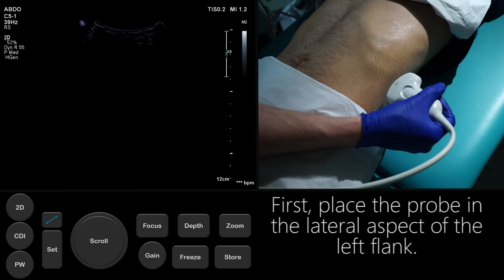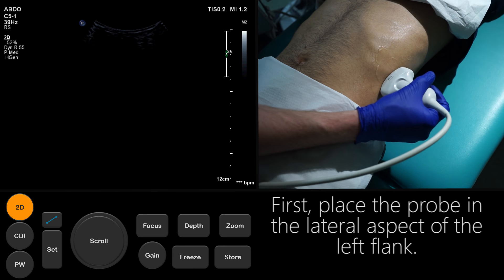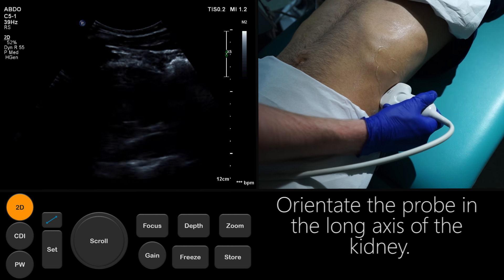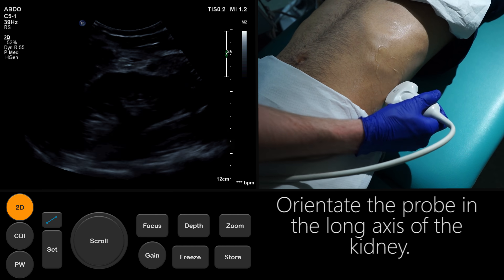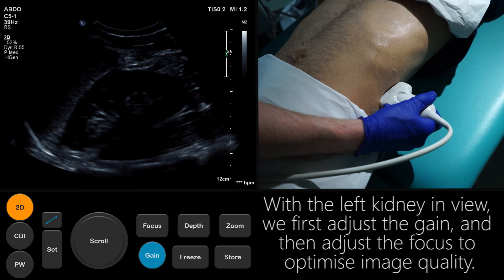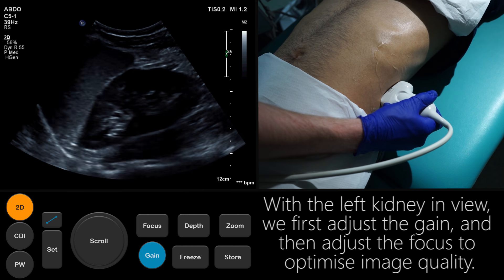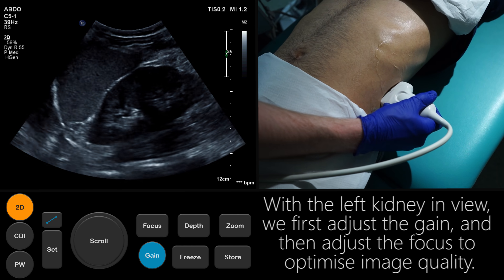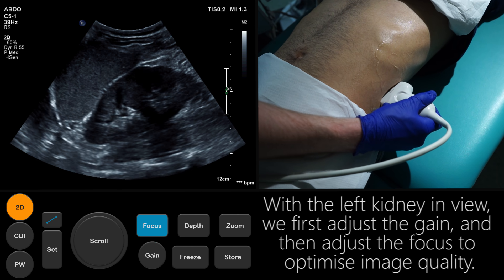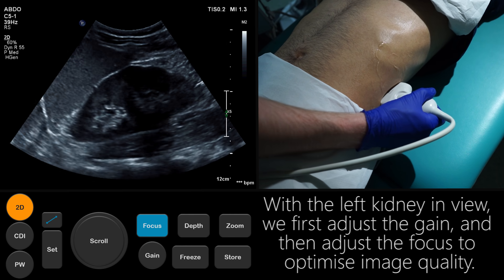Let's start with the left kidney. First, place the probe in the lateral aspect of the left flank. Orientate the probe in the long axis of the kidney. With the left kidney in view, we first adjust the gain and then adjust the focus to optimize image quality.